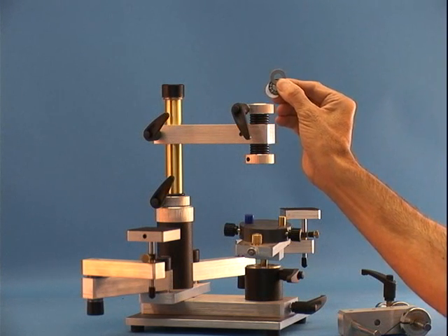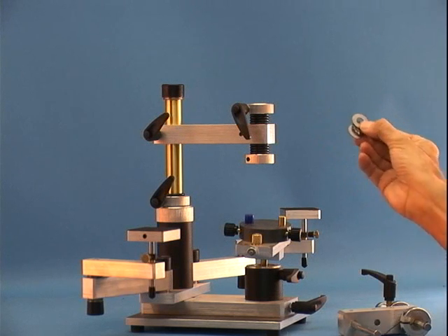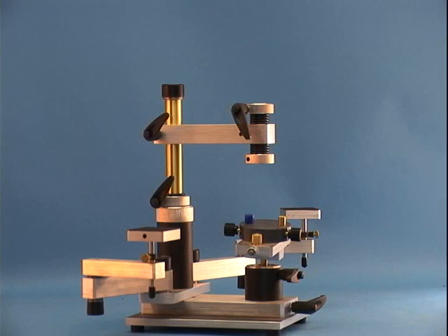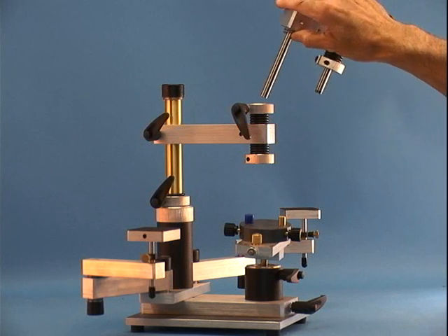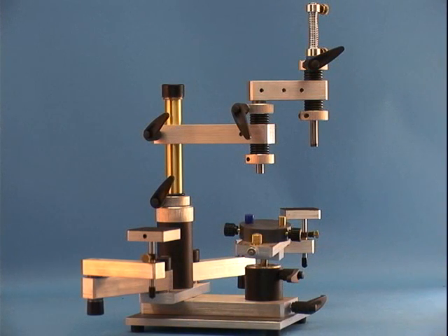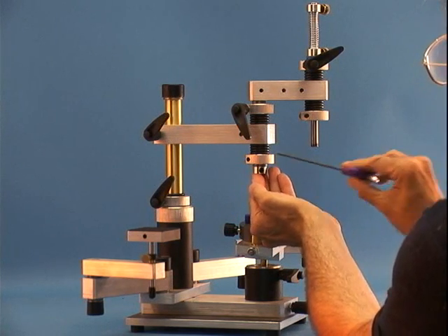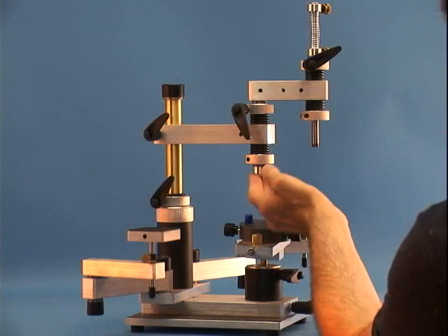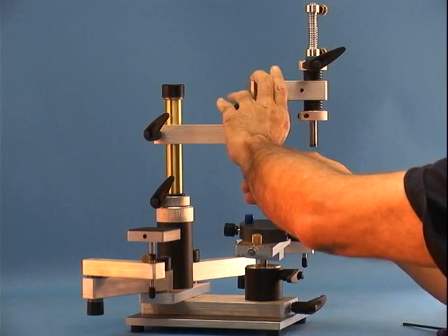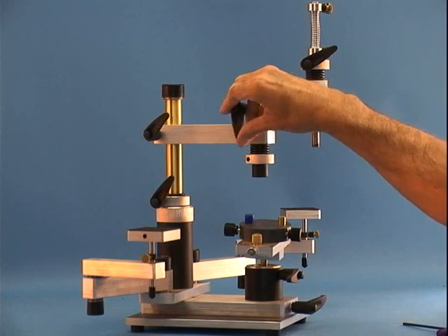This is the bearing assembly. It consists of a bearing sandwiched between two precision washers. Slide the bearing assembly on the shaft of the secondary arm and insert it in the primary arm. Now insert the second or lower bearing assembly on the shaft and lock it in place with the collar. Snap on the black cap. The secondary arm is now installed.